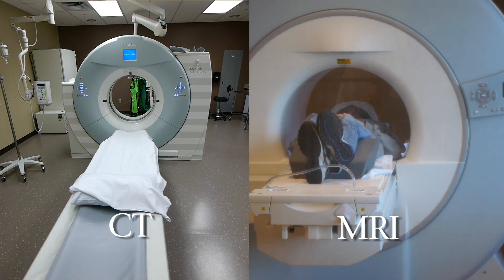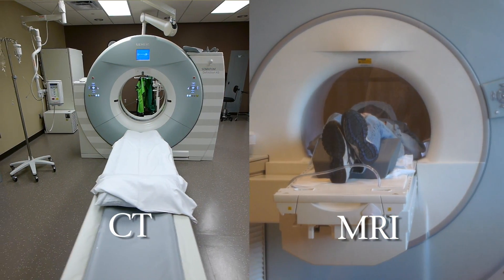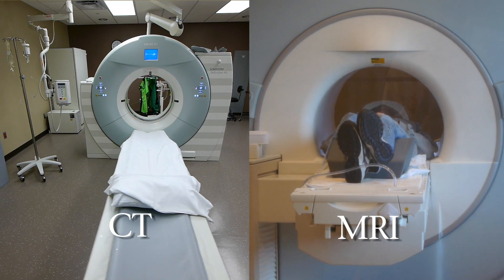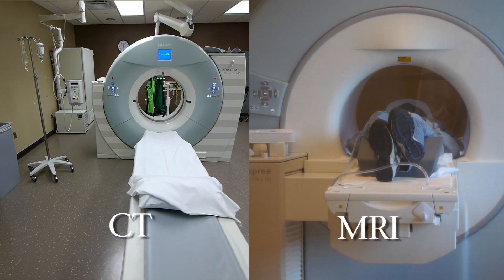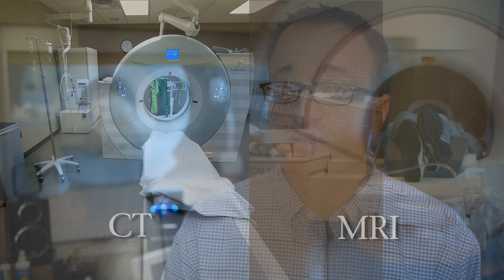The other major difference between the two is quite simply scan speed. A CT scanner in today's world — an abdomen and pelvis CT, for example — will take on average about 15 seconds to do the entire scan. Whereas an MRI to do the same imaging is going to take closer to 45 minutes. So it's a significant time difference.